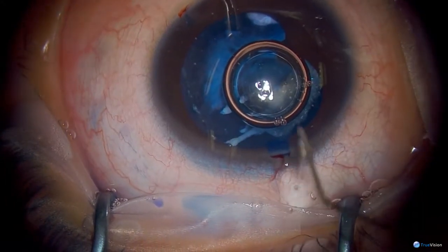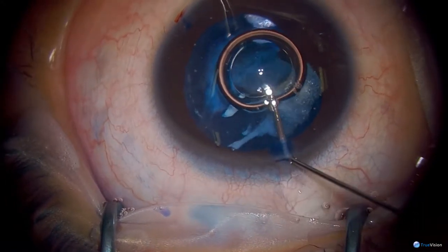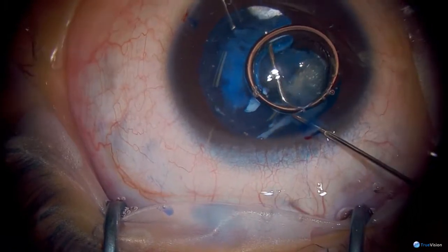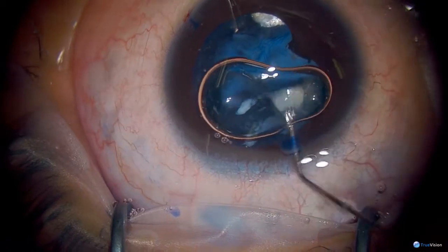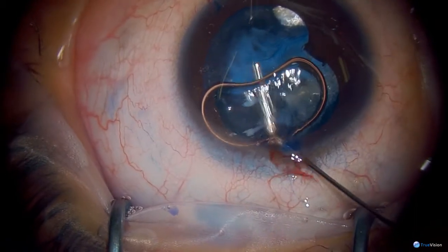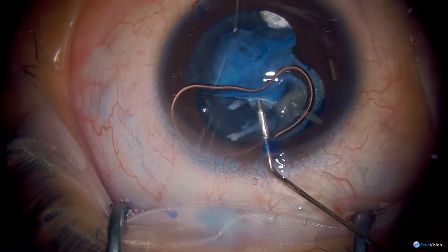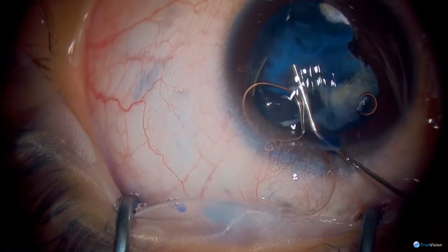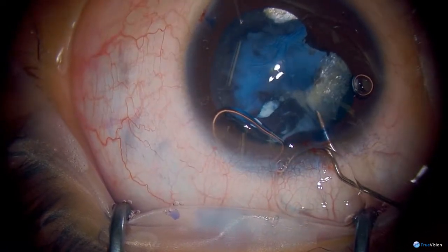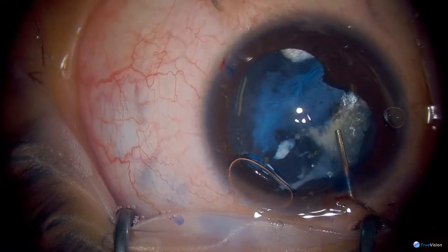So we're not entirely sure what happened. We were wondering whether there was some previous unseen trauma, and that can definitely happen sometimes with children. So the lens is mostly resorbed, so we have mostly a fibrous area centrally. So we're going to remove that plaque and place a lens in the sulcus and capture it.